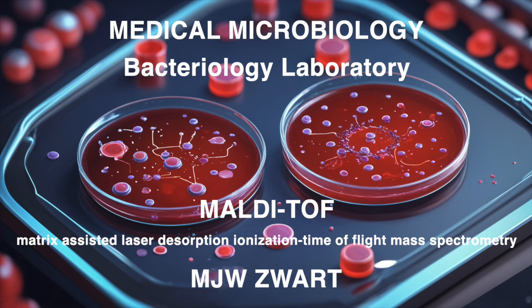Okay, so if you're working with, let's say, blood cultures in those BACTEC bottles, there's a specific procedure where you use a solution to break down the red blood cells and concentrate the bacteria. But, and this is important, the document really stresses this, you can't use the direct identification method on any potential class 3 pathogens from those bottles. So safety first. Makes sense. You'd have to work with cultures from plates in those cases.